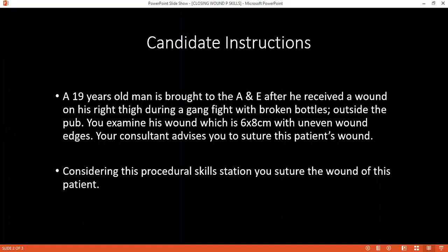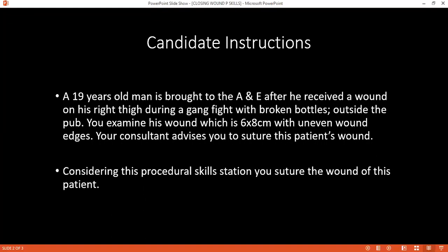As it is an uneven wound, I will debride the local tissue, wash the wound, and convert it into a surgical wound. I will use normal saline for washing, and I can use hydrogen peroxide to remove any foreign body. Copious irrigation will be done. I will debride the wound margins and then start with interrupted sutures, because I am expecting a contaminated wound.